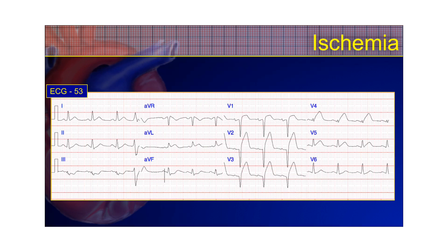Here's the very next EKG from that same patient. Now you can see in those anterior leads the ischemia has turned into injury. In fact, some infarction is probably occurring as well, with QS-waves where there's no R-wave — that's not normal and is pathognomic of infarction. A QS-wave can be considered the same as a pathological Q-wave.